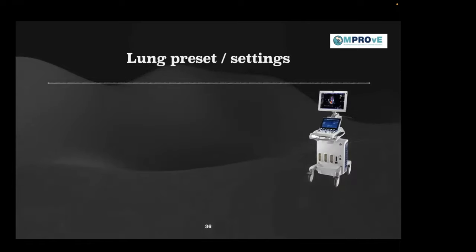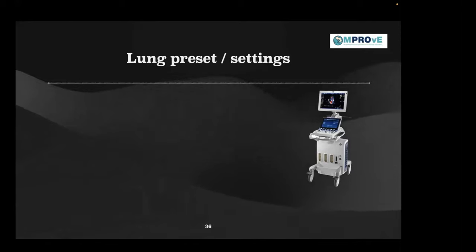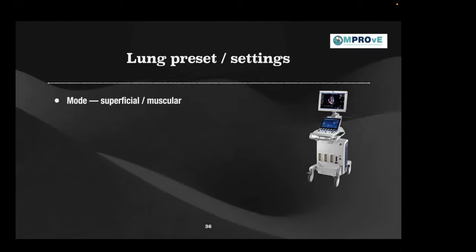Right, now coming on to lung presets. So what kind of a preset? The new fancier machines have started coming with the lung preset now, but the old machines are also good. They are actually better, without the harmonics, which sort of clear all your artifacts. We're going to discuss what kind of a setting we can use to make use of any ultrasound scanner to do a lung scan.